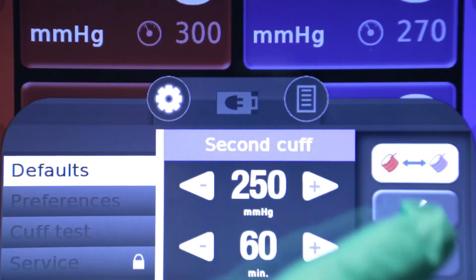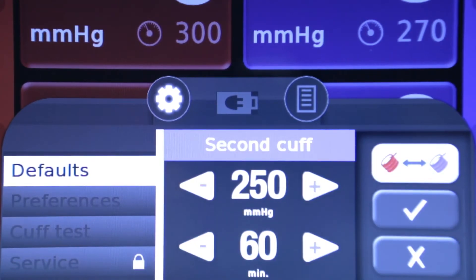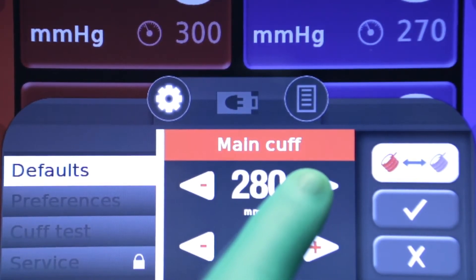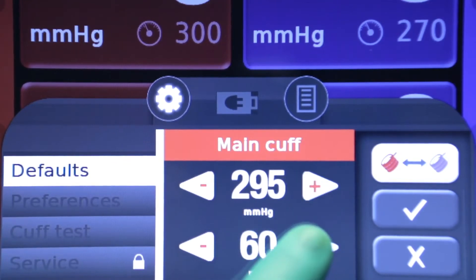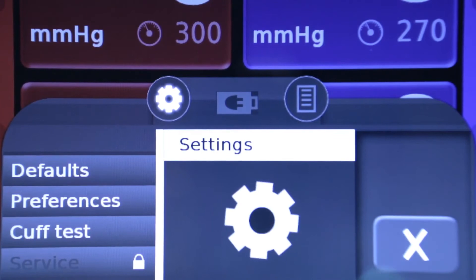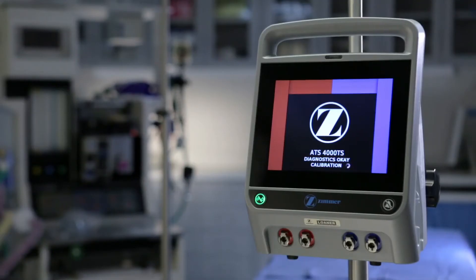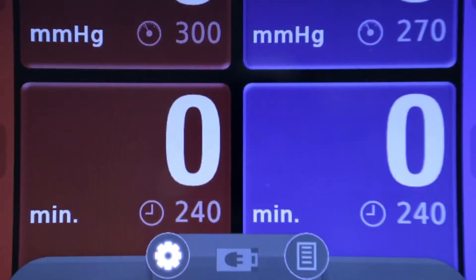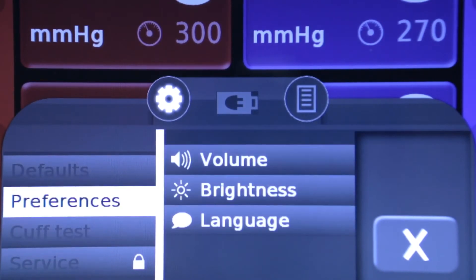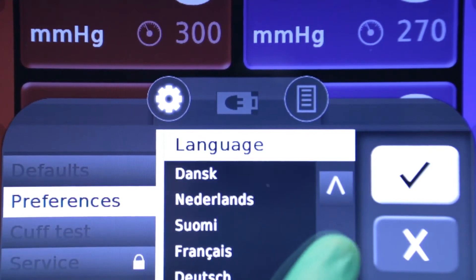Tap the cuff toggle button to switch between the main and second cuff. Tap the left arrow button to decrease or the right arrow button to increase the default pressure or time. Tap and hold either button to change the setting in 5-unit increments. Tap the OK button to save the indicated pressure or time as the new default setting. The new settings are stored in memory but will not take effect until the machine is restarted. The settings menu also allows the ability to change user preferences, including brightness, volume, and language.